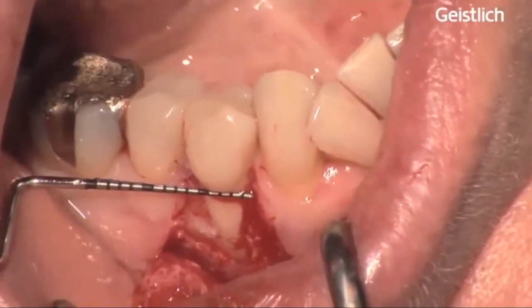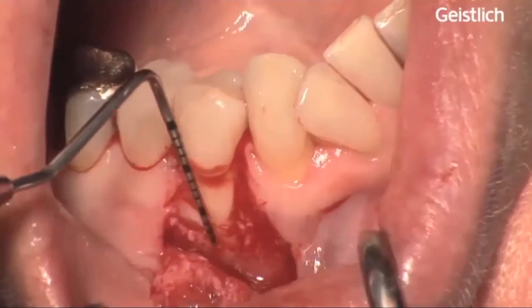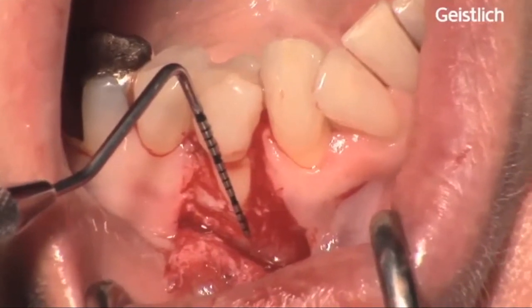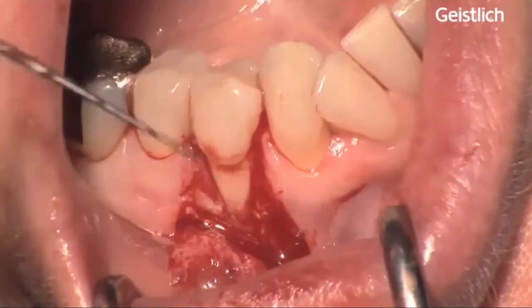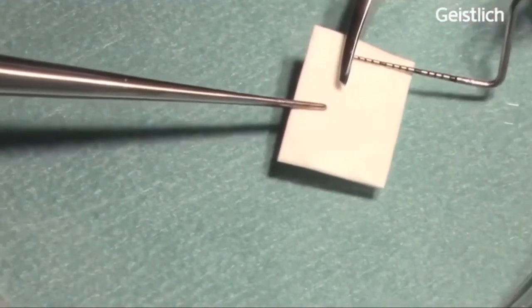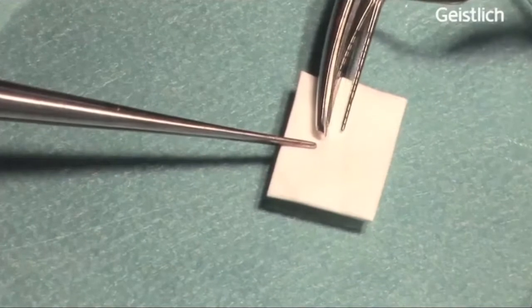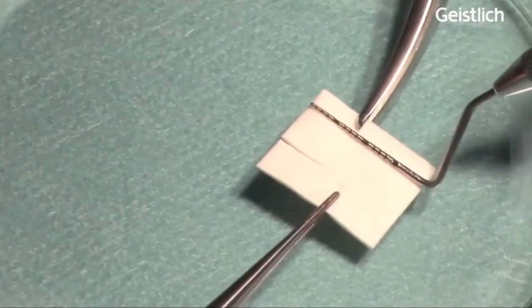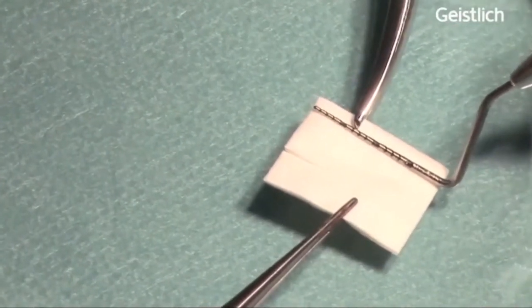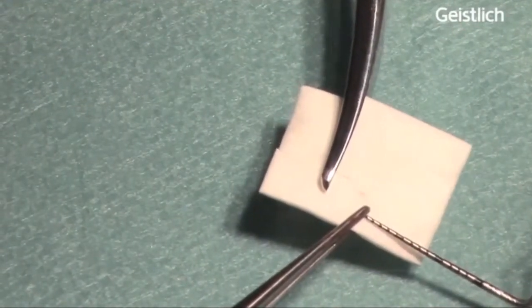The defect size now is 4 mm wide and 7 mm high and needs to be measured again to determine the size of the mucograft matrix needed. The matrix is cut to size — 9 mm long and 6 mm wide — in order to slightly overlap the defect. The mucograft is placed on the prepared recipient bed with the smooth surface facing the oral cavity and the porous surface facing the bone.